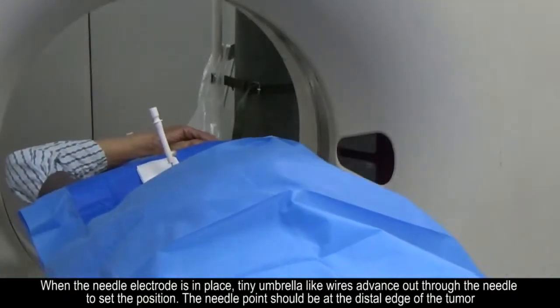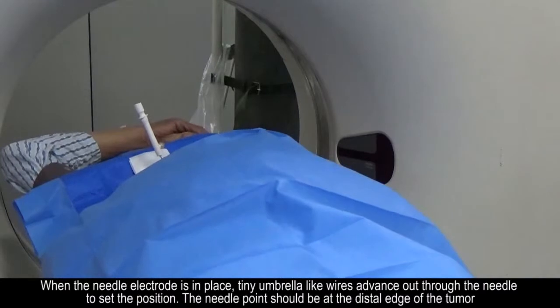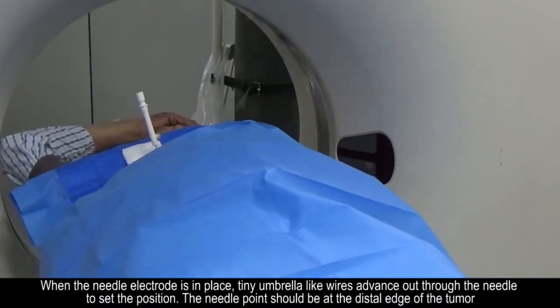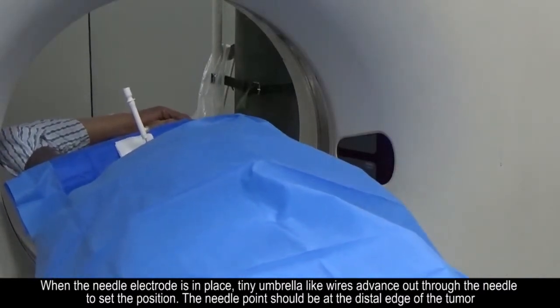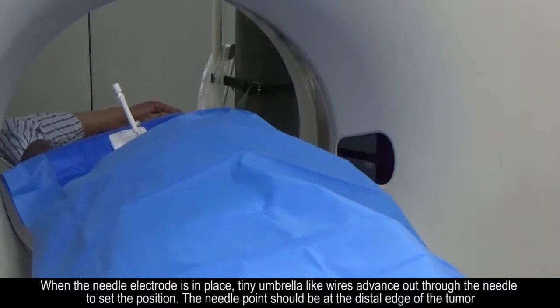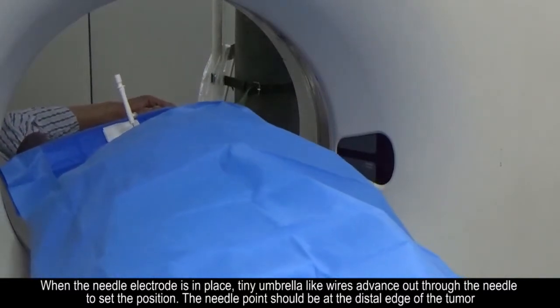When the needle electrode is in place, tiny umbrella-like wires advance out through the needle to set the position. The needle point should be at the distal edge of the tumor.